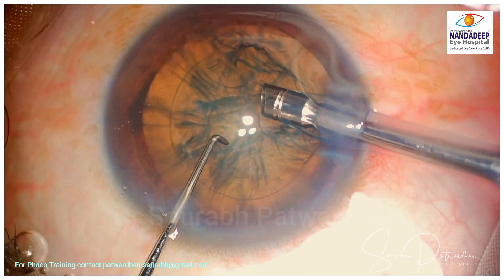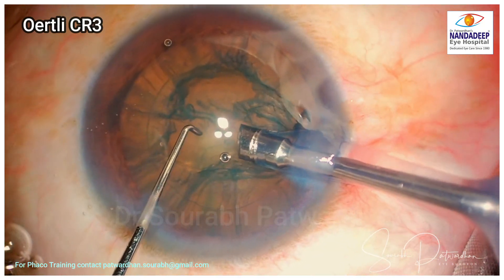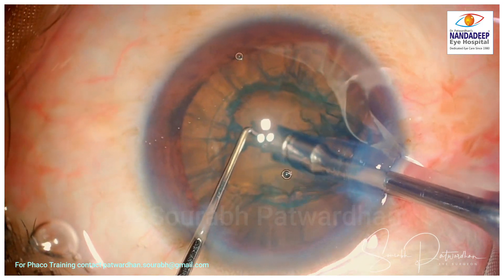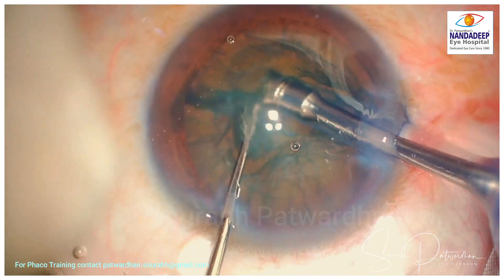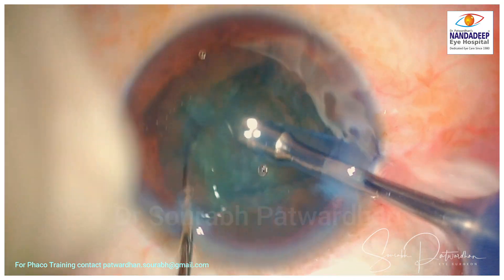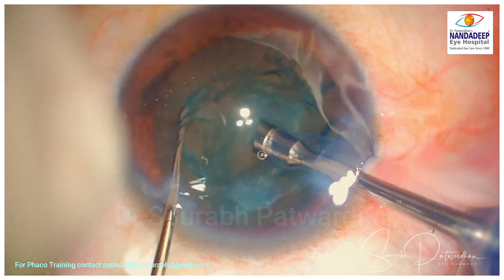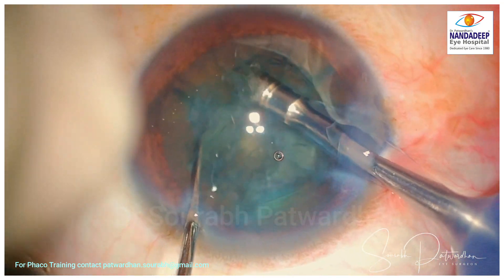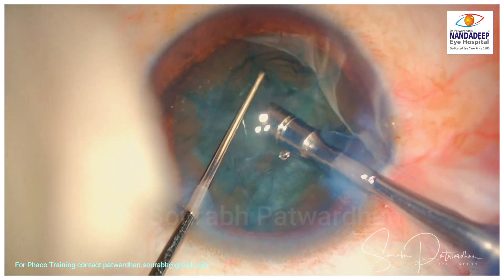In this case, I am going to use the Alaris CR3 machine. This is a grade 1 cataract and the plan is to divide this soft nucleus into pieces and then do FACO aspiration. Being a soft cataract, it's always difficult to chop this kind of nucleus. I am going to use very low flow and low vacuum initially, and once I find a division, I can take a piece out from the bag and go to higher vacuum settings.